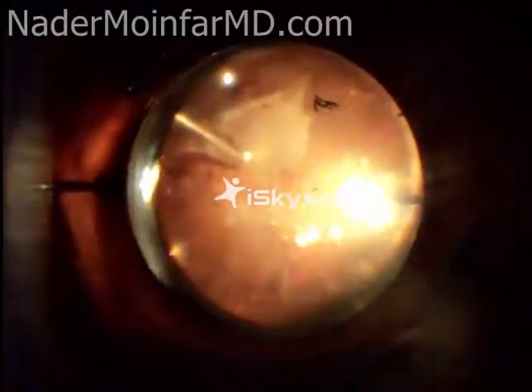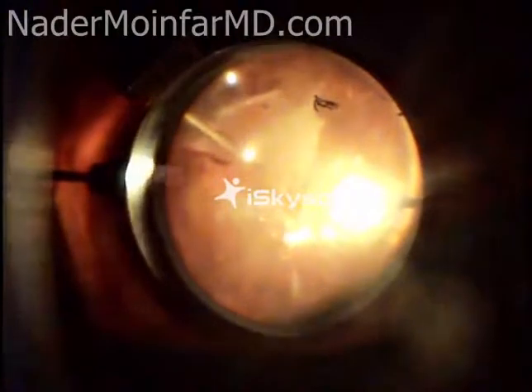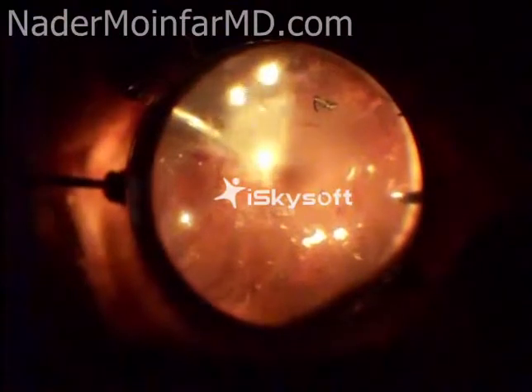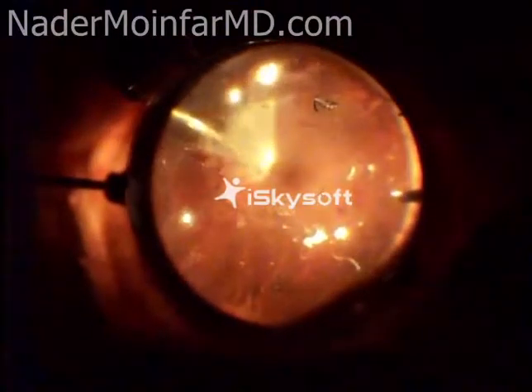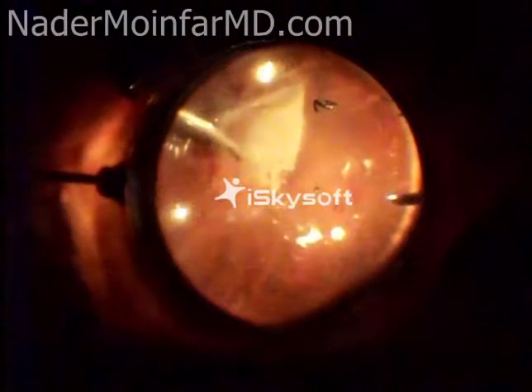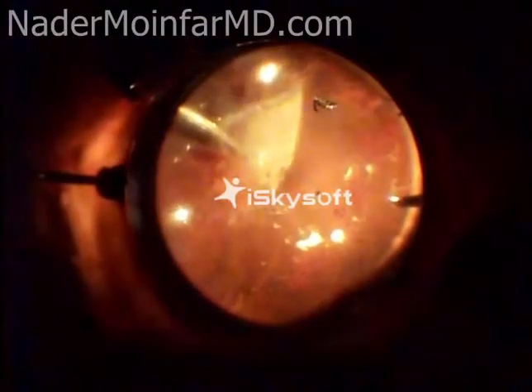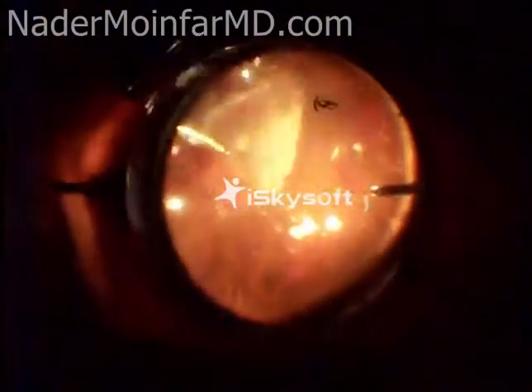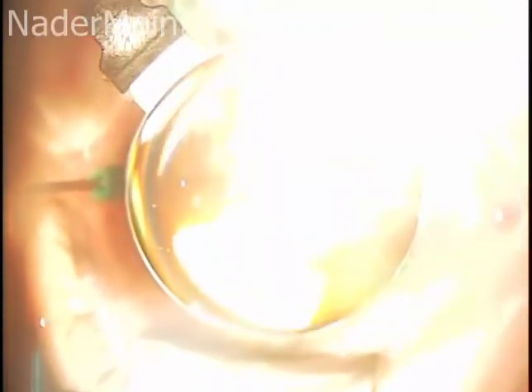You may have noticed the air bubbles going in, and that replaces the saline fluid that I am aspirating out. The reason for doing this is several. One, it allows for a better view of the retinal periphery allowing for more extensive laser, and also it helps control any bleeding as well. In a moment you'll see me exchanging one instrument for another, which is the laser probe.